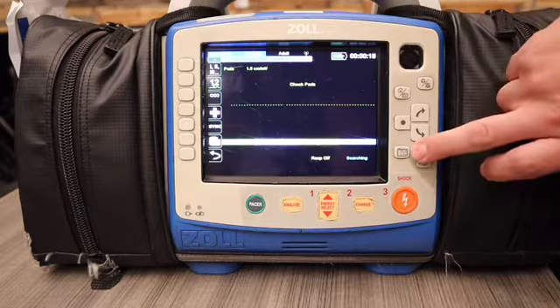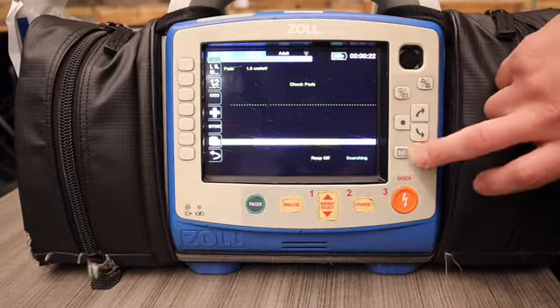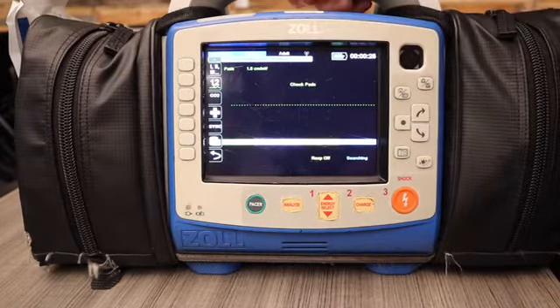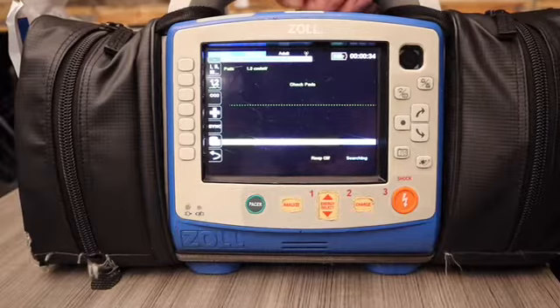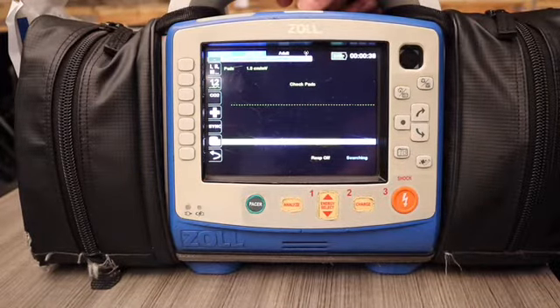This button is a snapshot button. Essentially, if I press this at any time while doing something like a four-lead, it's going to record 12 seconds prior and 12 seconds after, and it's going to print it out so that we have a good reference if we had some cardiac event we wanted to show the doctor.